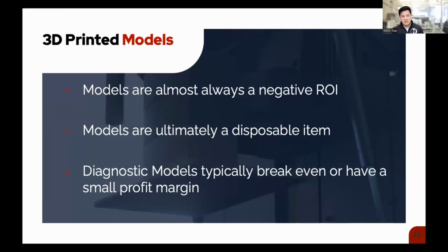Back in the day, when I was discussing waxing these things up by hand, you couldn't really charge too much because, how much can you really build into a bill for something so large? So typically you're charging, whatever it may be, $20 an hour, enough to cover somebody's labor for the amount of time that it takes, $20 per unit, what we typically build out for ours. And if you're doing a full upper and lower, that's a full 8-hour day of waxing up, if you really want to focus on the details. Typically it wasn't. Maybe you give it to a more junior technician, maybe to spend a little bit less time. Maybe the details aren't exactly what you want, but it kind of gives you the vertical and the general proportions of what you want to achieve.